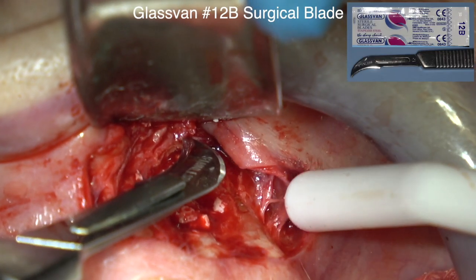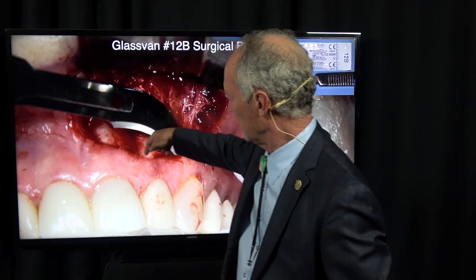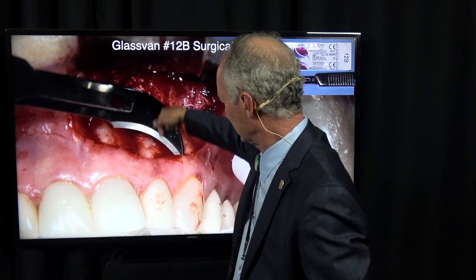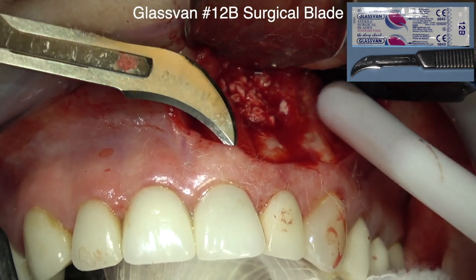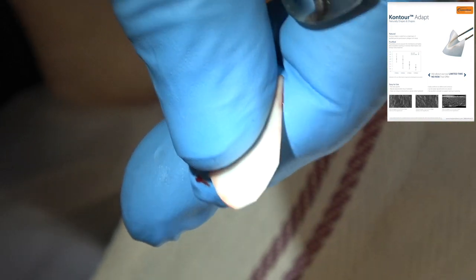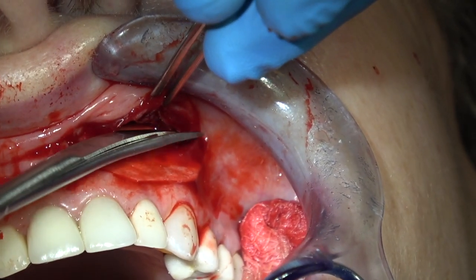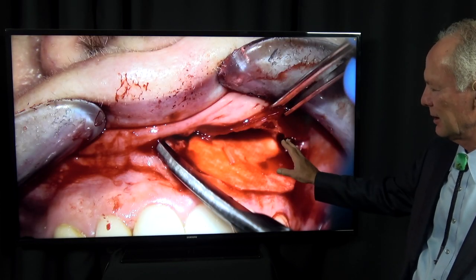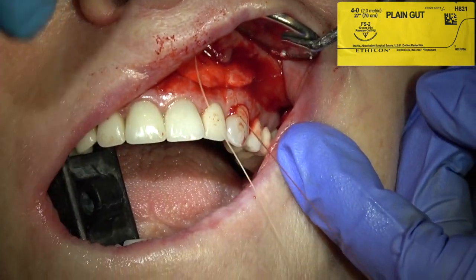I'm releasing the incision a little bit more. This is very important for suturing: if your incision is in attached gingiva, you want to just open that up just a little bit right at the bone line between the bone and the attached gingiva, just so you can get your suture needle under the tissue — otherwise it's very difficult. Now this is a membrane. The purpose of a membrane is to give the bone a head start on the soft tissue. Soft tissue grows a lot faster than bone, so with this membrane over the defect with the bone graft, the bone is going to have a head start — you want that defect to fill with bone, not soft tissue.